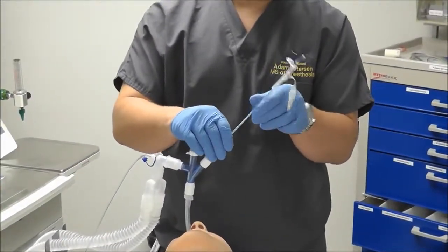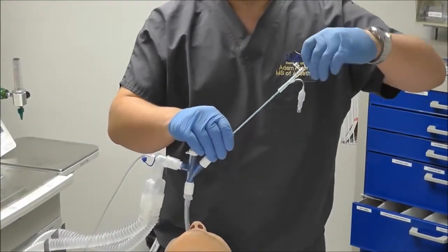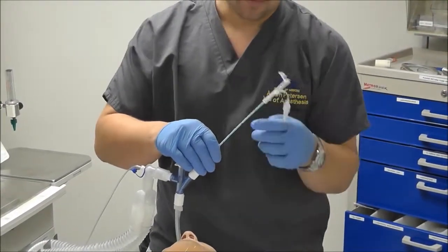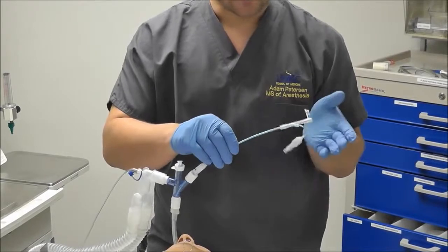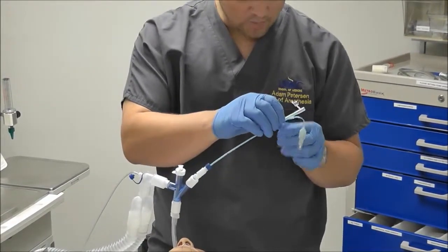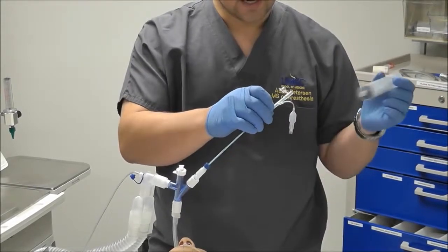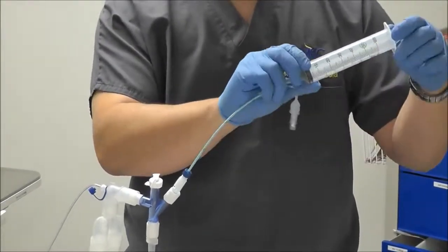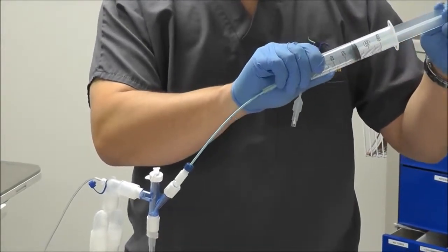On the bronchial blocker, there's a metal stylet at the end. Go ahead and remove the metal stylet, thereby exposing the lung to atmosphere. This will deflate the lung. If you need to help deflation of the lung, you can take a luer lock syringe, place it on the end of the bronchial blocker, and suction out even more.